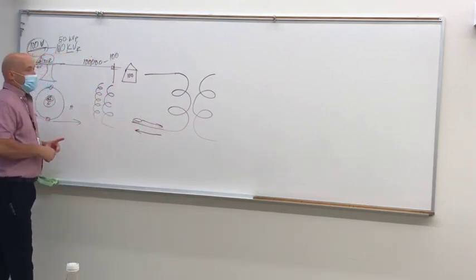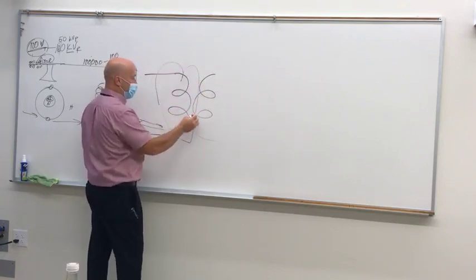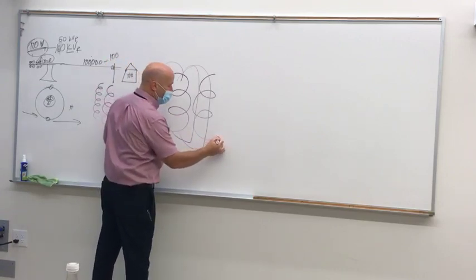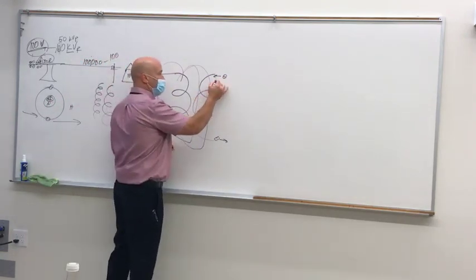The importance of that is that if we move another coil of wire close to it, that magnetic field reaching out will go through this coil of wire and in turn create electric flow in the opposite coil that goes back and forth as well, okay?